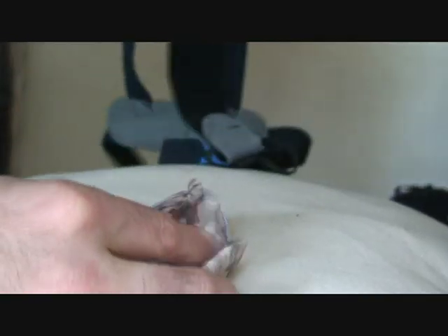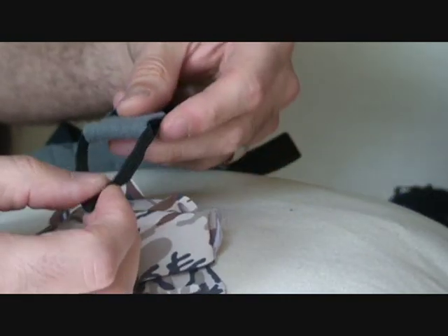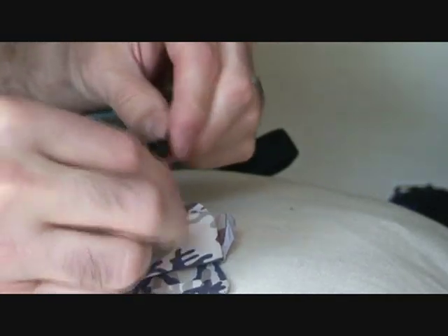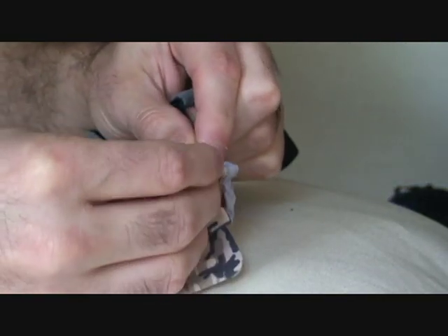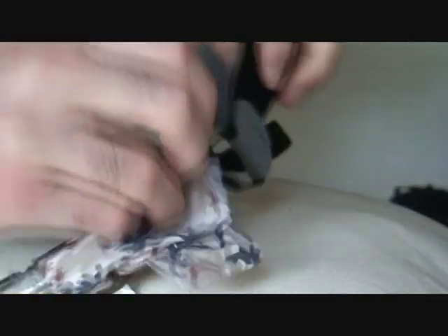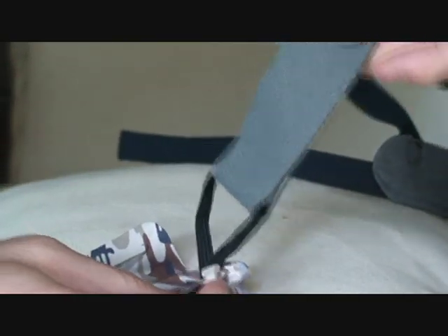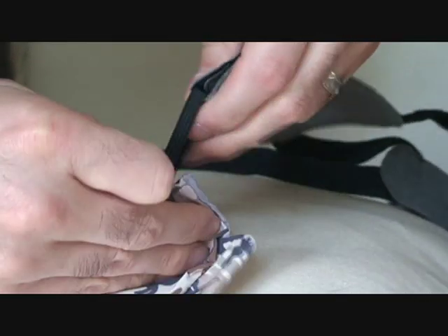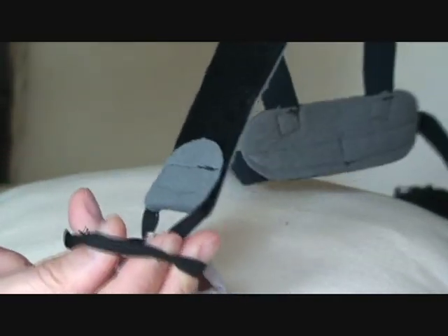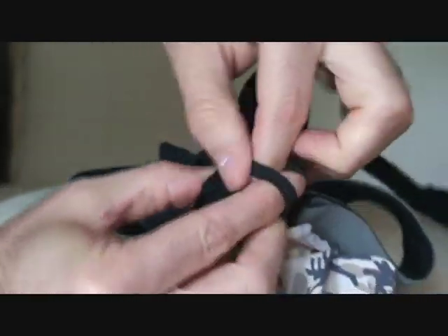So putting the new one on, you want to thread this thing through first, the elastic piece through the top of the nose. Okay, and so the gray side is going to be down. It's not a huge deal, but you want to try to angle it so that it's going to come out right. Anyway, you take the entire mask, open a little hole, push it all through.